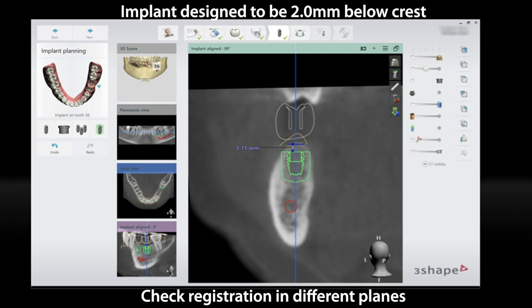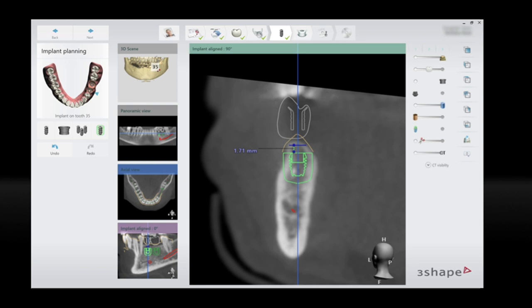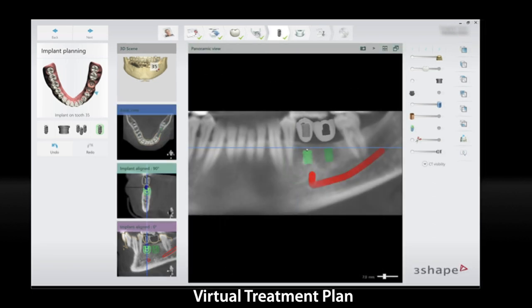As you can see, the implant is virtually placed to be around 2 millimeters below the crest of the ridge. Again, virtual implant simulation at site 3-6 using 4.5x6 Bicon implants. And this is a panoramic view showing the relations of the two implants to each other and to the inferior alveolar canal.